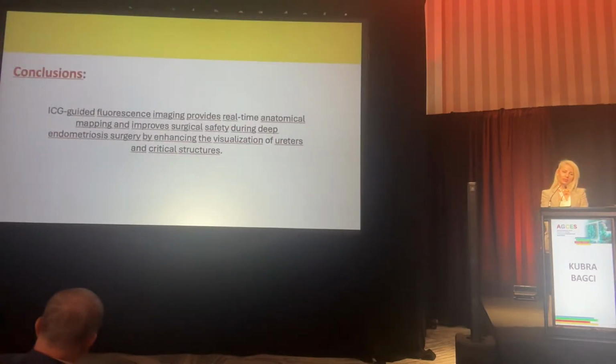ICG-guided fluorescence imaging provides real-time anatomical mapping and improves surgical safety during deep endometriosis surgery by enhancing the visualization of ureters and critical structures.